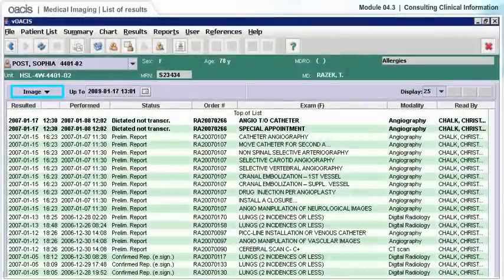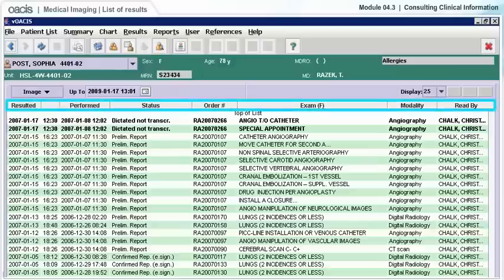The medical imaging results list allows you to access different test results for the selected patient. To learn more about the content of each column, go over them slowly with your cursor.